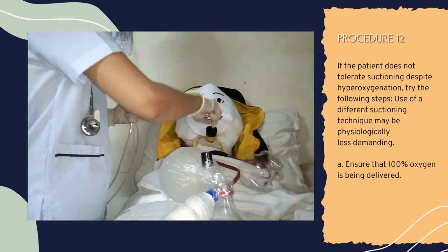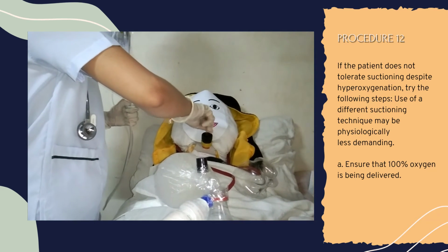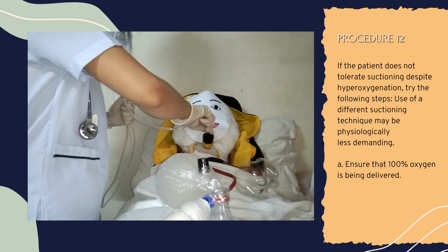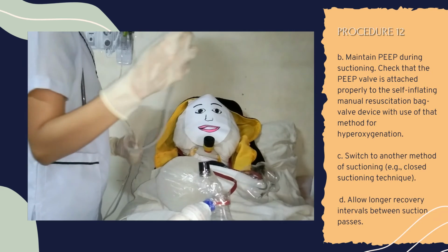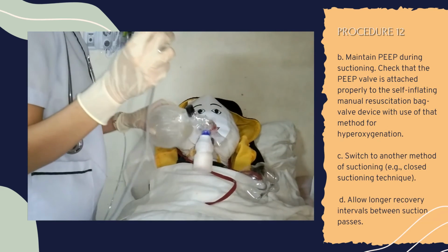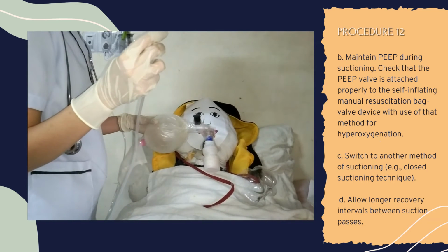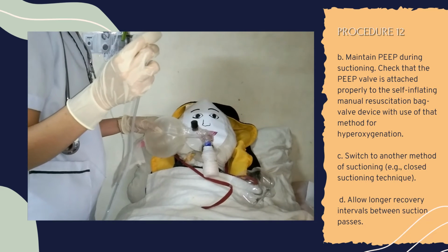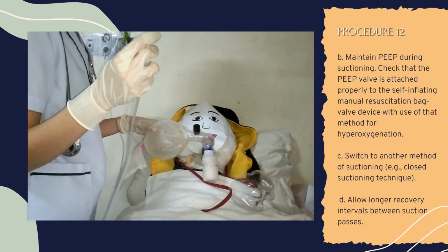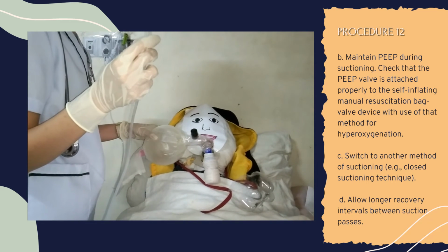If the patient does not tolerate suctioning despite hyperoxygenation, try different steps. Use of a different suctioning technique may be physiologically less demanding. Ensure that 100% oxygen is being delivered. Maintain PEEP during suctioning. Check that the PEEP valve is attached properly to the self-inflating manual resuscitation valve device if using that method for hyperoxygenation. Maintenance of PEEP prevents collapse of alveoli during suctioning.